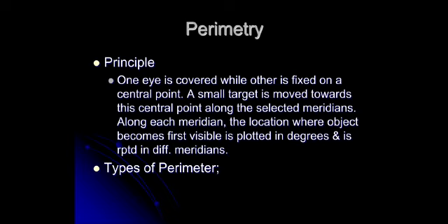So we have a large and a small oval that represent the approximate size of normal blind spots. You can see that the radii are the meridians. The round circles at every 10 degrees are your isopters.